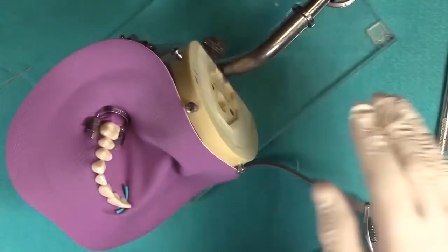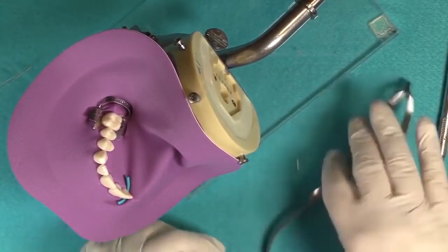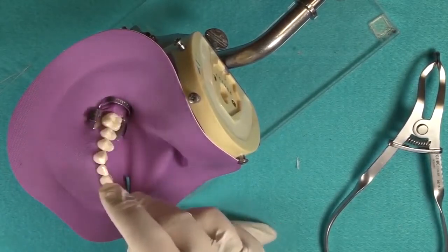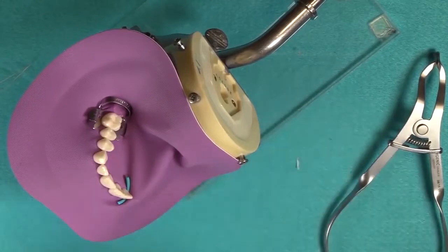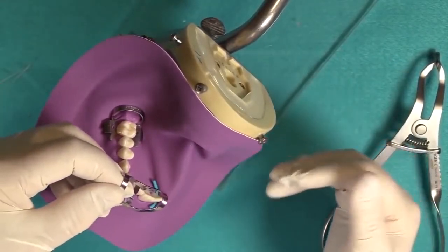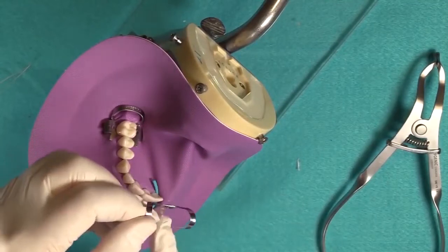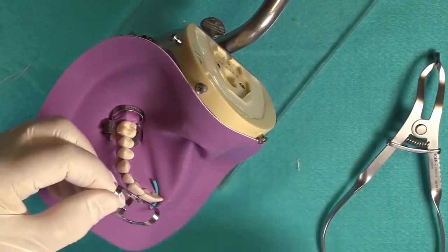Now, let's continue on with the class 5. So normally what would happen in the sequence, the doctor would prepare the teeth. Now, when it comes to the class 5, and you need your retractor clamp, then you could place that on. And I'm at the 11 o'clock position. If you're a left-handed person, you're at 1 o'clock. And remember I told you there's notches on either side. That's because you may be right-handed or left-handed, see?